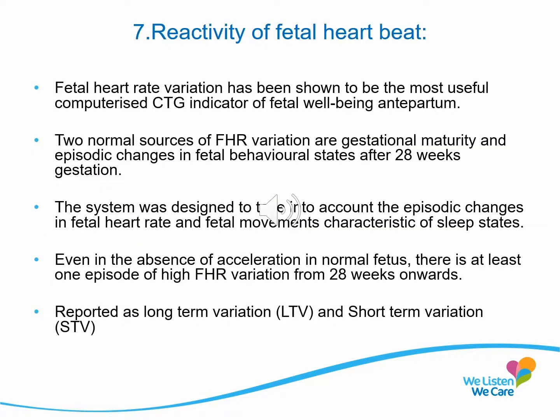Now, the most important feature of computerized CTG is the reactivity of fetal heartbeat. Fetal heart rate variation has been shown to be the most useful computerized CTG indicator of fetal well-being in antepartum. 2 normal sources of fetal heart rate variation are gestational maturity and episodic changes in fetal behavioral states after 28 weeks gestation.